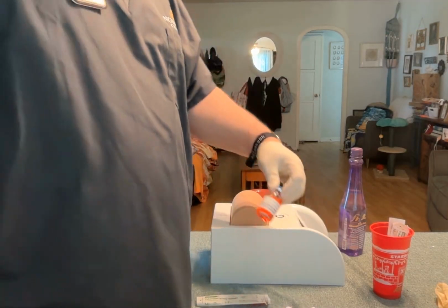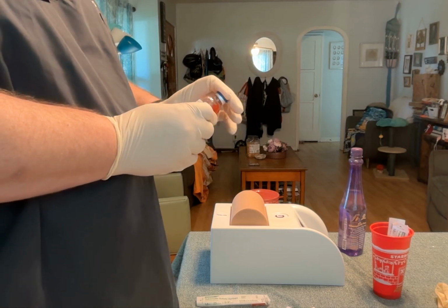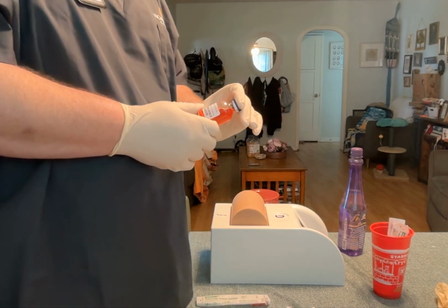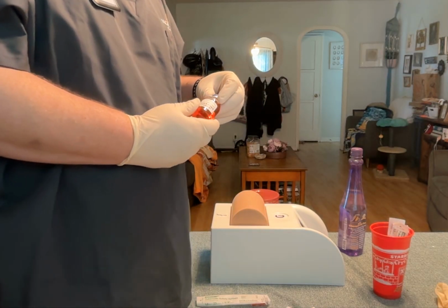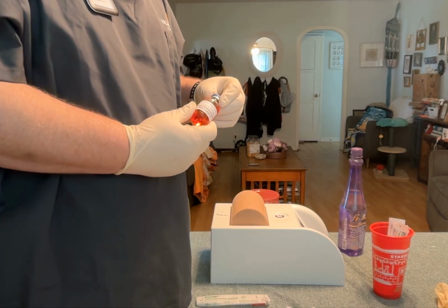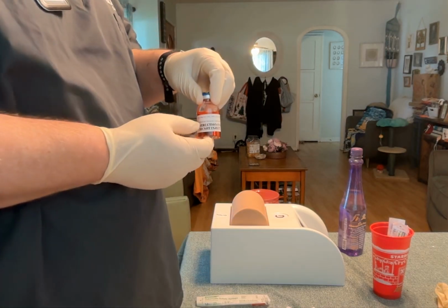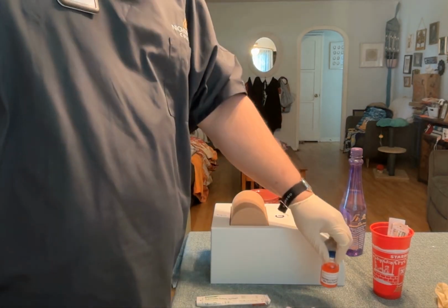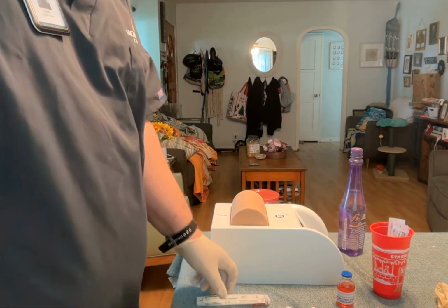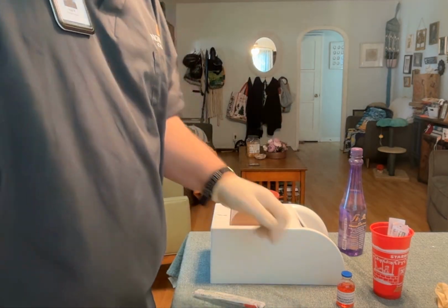Again, I'm going to check my orders. In my vial, my concentration is 10,000 units per every 10 mLs. So to get 1,000 units, I'm going to give her 1 milliliter of the solution, which is 1,000 units of the heparin. I have my syringe, I have my gauze, I have my wipes.